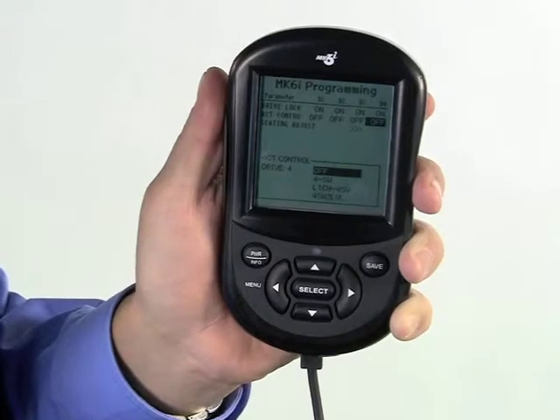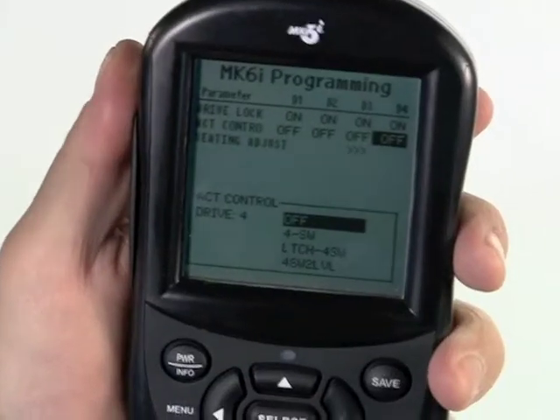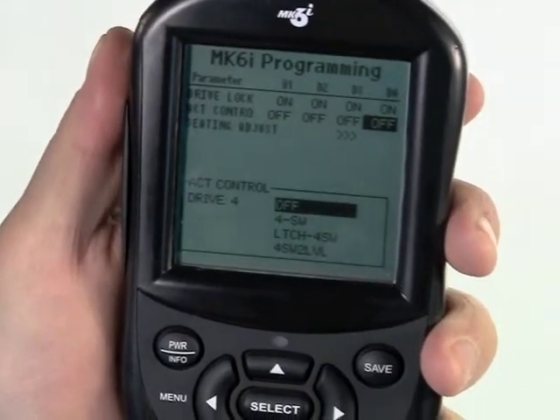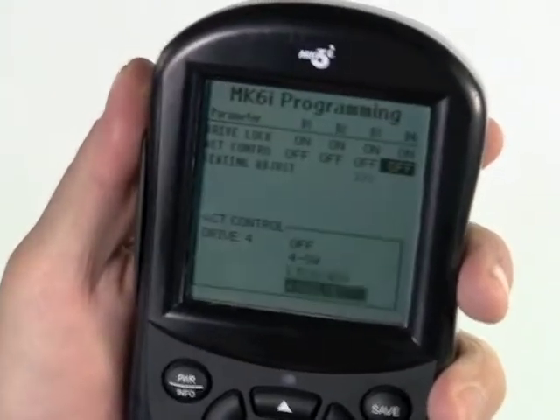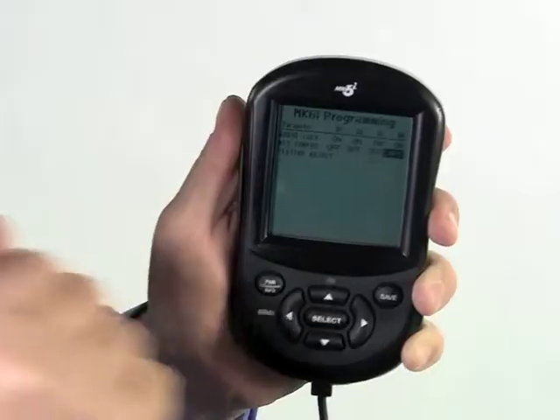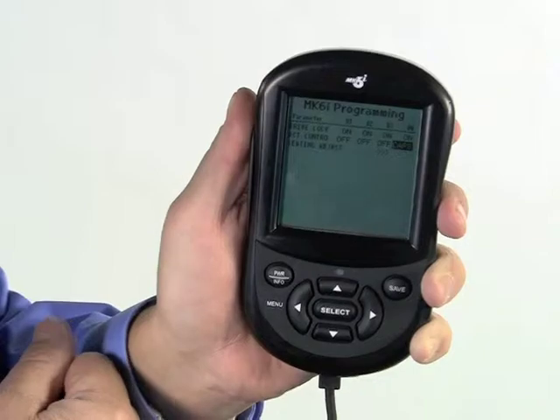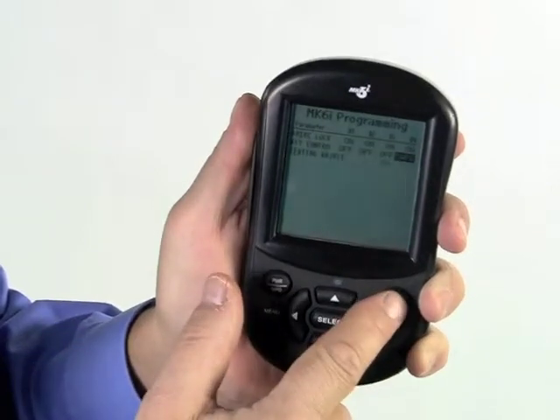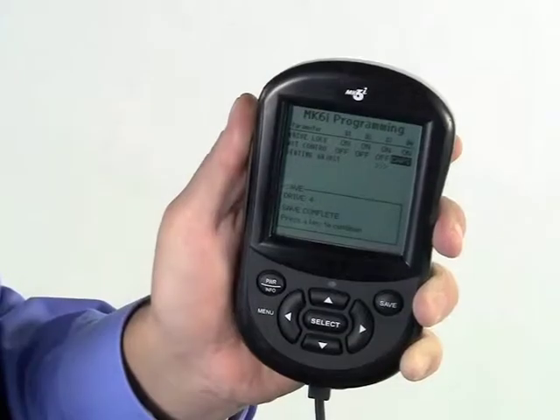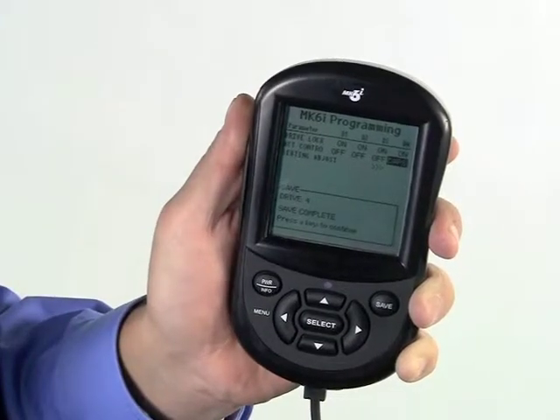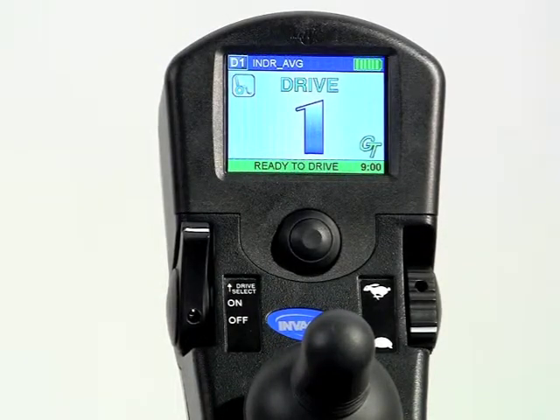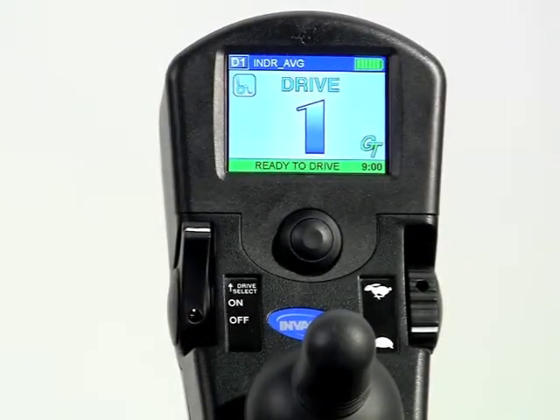Choose the appropriate control setting. In this case, we will choose CAPS, which stands for cycling actuators with powered seating. Press the save key twice, and you are finished. You have now dedicated drive four to only operating powered seating on your Mark VI driver control.